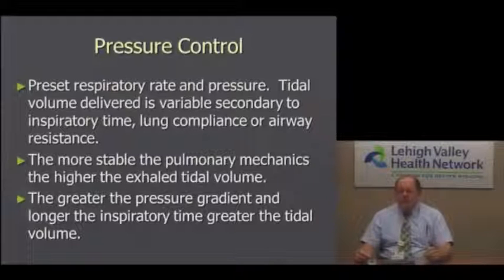So patients in pressure control have to be monitored very closely, and their alarms have to be tighter than in volume ventilation, okay? The other thing we forget a lot of the time is that the patient may get too much ventilation. For example, if I have an asthmatic on pressure control and their exhaled tidal volumes are 300-400 cc's, and all of a sudden the beta agonists, the steroids kick in and their lungs open up, now that exhaled tidal volume can double.